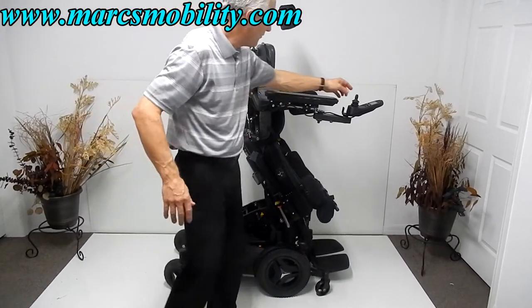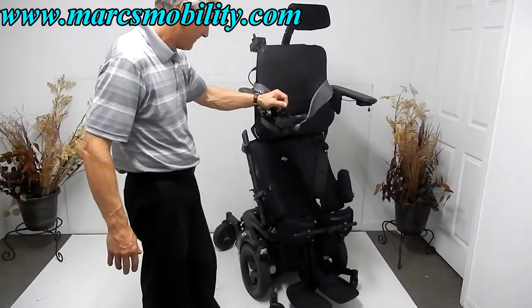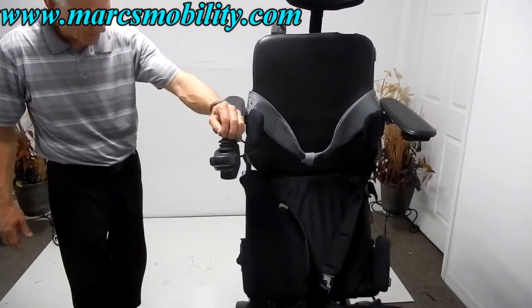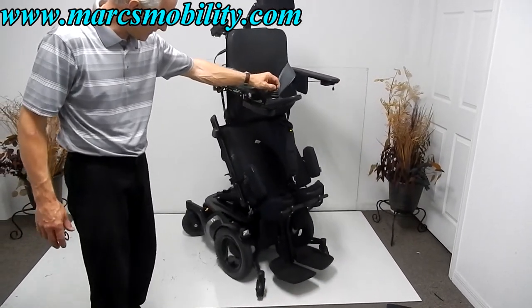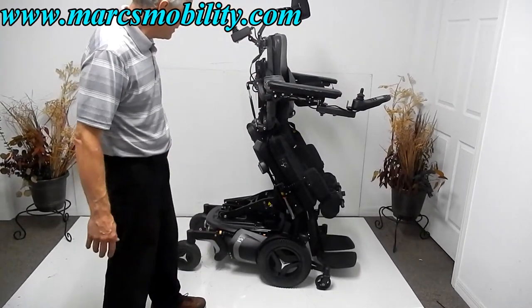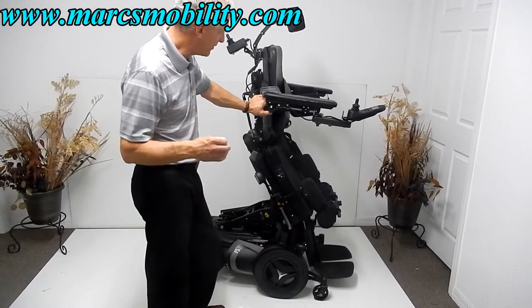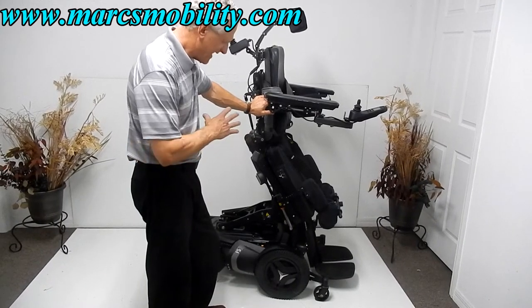This is the standing position. You can also drive the chair while standing — back and forth — though at a reduced speed. If you need a chair with a standing position, this is a beauty. This is the latest technology that Permobil came out with, and this chair has everything.